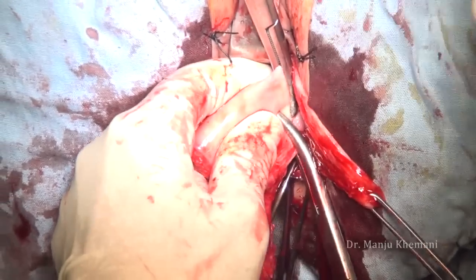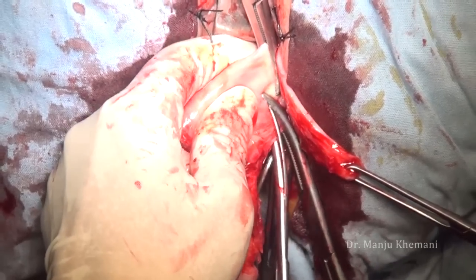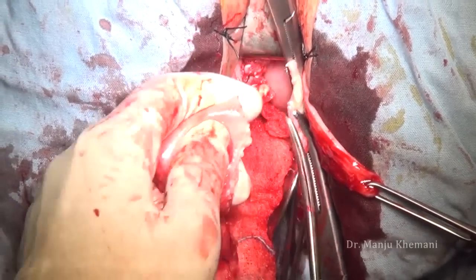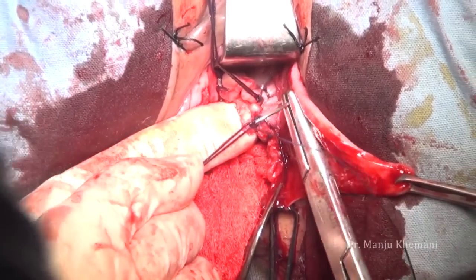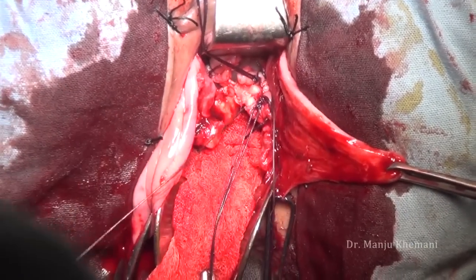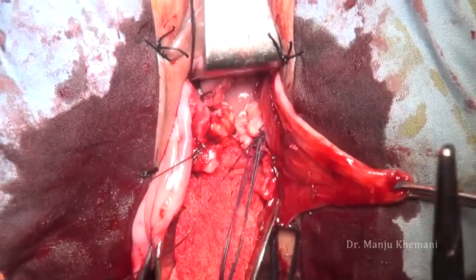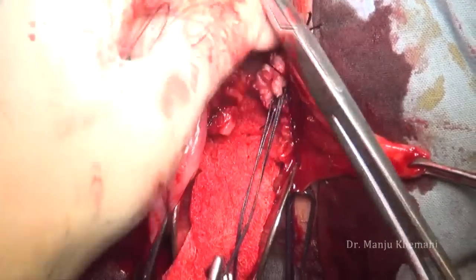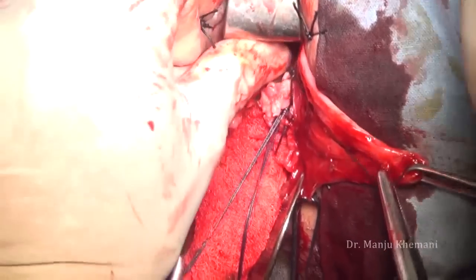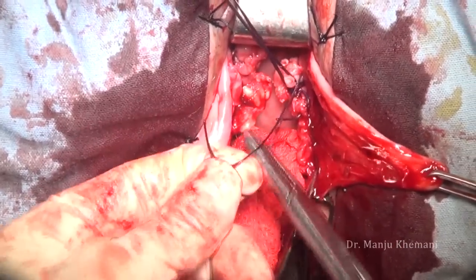Transfix it, and once it is transfixed take a second ligature to be 100% sure that there will be no later bleeding. If you are in the correct plane with no problem opening both peritonea, your uterus will be out in the first 10 minutes. Now comes the most important thing — repair.